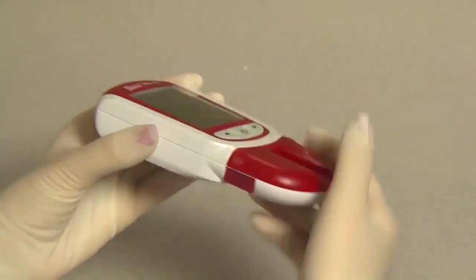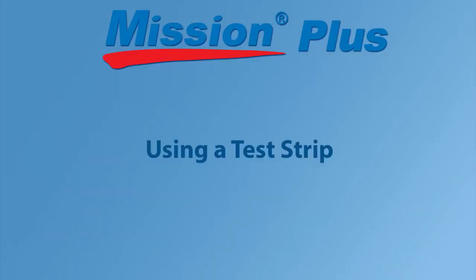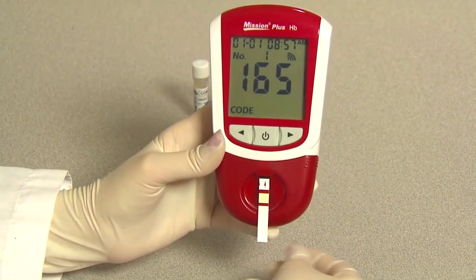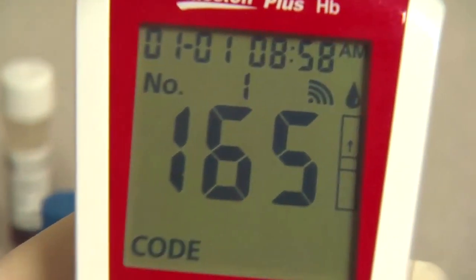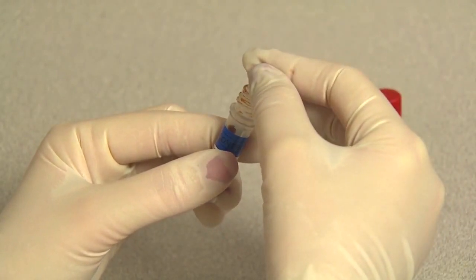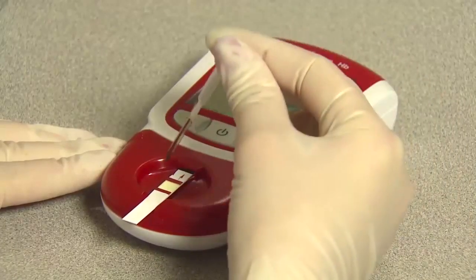Check that the code chip number on the LCD screen matches the inserted code chip. Using a test strip, wait for the meter to flash the test strip symbol. Insert the test strip completely into the test strip channel in the same direction as the arrows printed on the test strip. The blood drop symbol will flash when the meter is ready for the specimen to be applied. While the blood drop symbol is still flashing, use a capillary transfer tube to apply 10 microliters of the control solution to the center of the specimen application area.